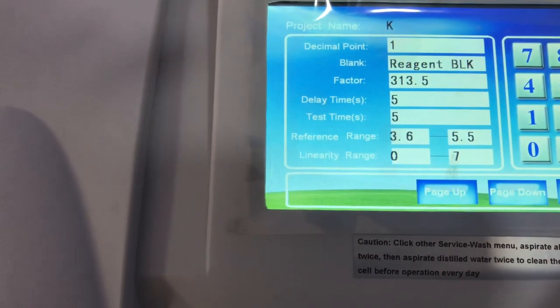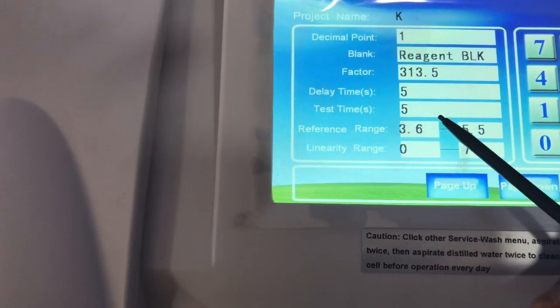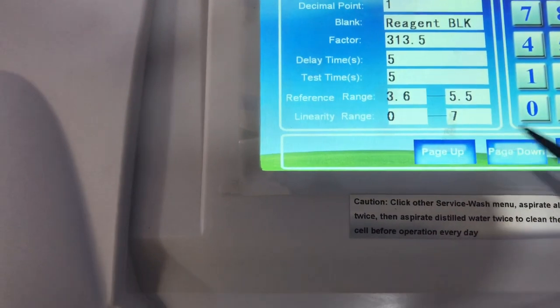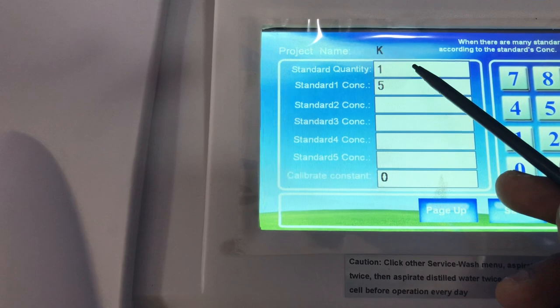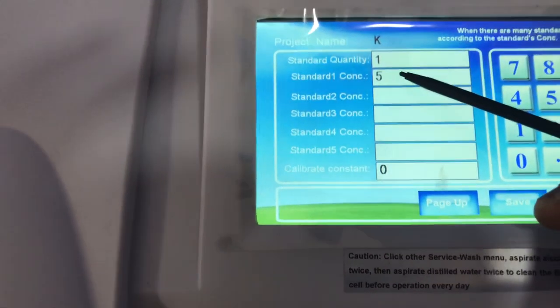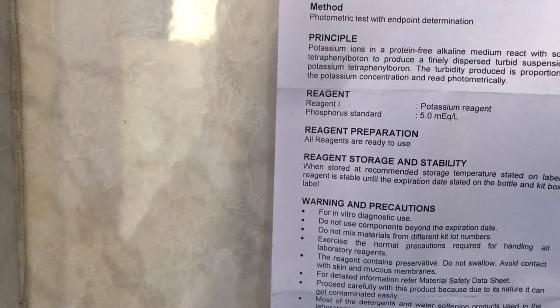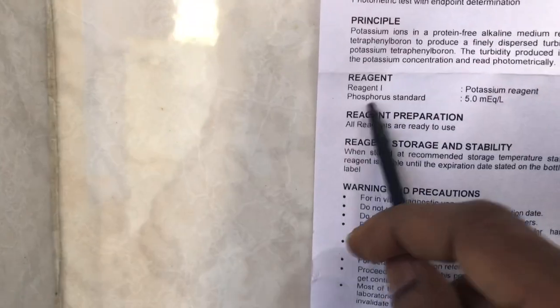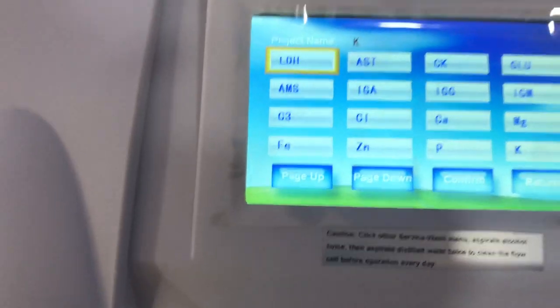For endpoint, the machine will calculate the factor for you; leave the factor field as is — the machine has already calculated it because I've used it before. The delay time for an endpoint is typically five minutes, and the test time is five minutes. Then enter the reference range and linearity range. For the number of standards in this assay, input one, and the standard concentration is 5 mEq/L as stated on the assay insert. Input the unit and click confirm — that's how you program for a parameter like potassium.